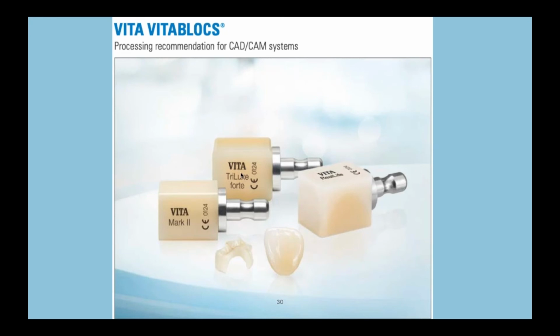Now they have the Trilux Forte. So Forte means strong in Latin, not four. So this four layers should have been Quattro, not Forte. Anyhow, it doesn't matter. These are very nice blocks. The Mark II is just fine. So if you're going to layer, you can just use a Mark II of the right shade, and you can build it up with your ceramic.